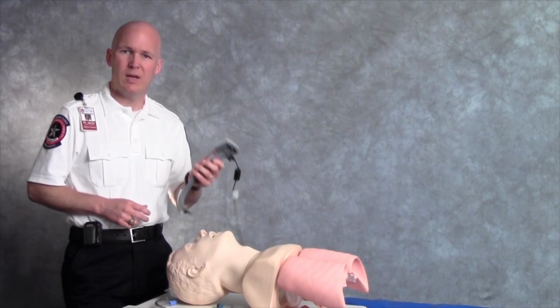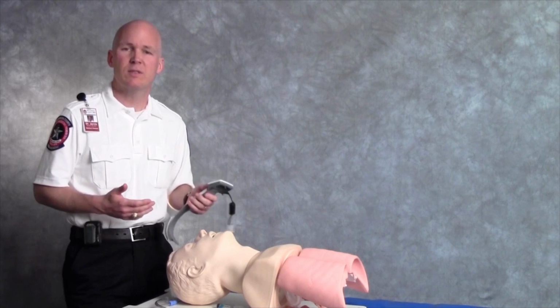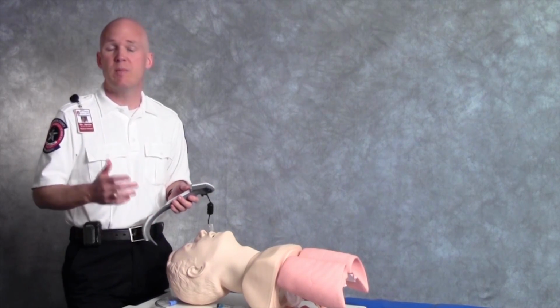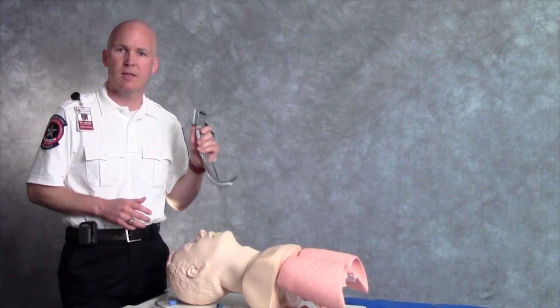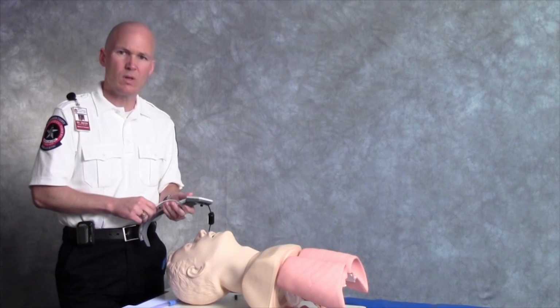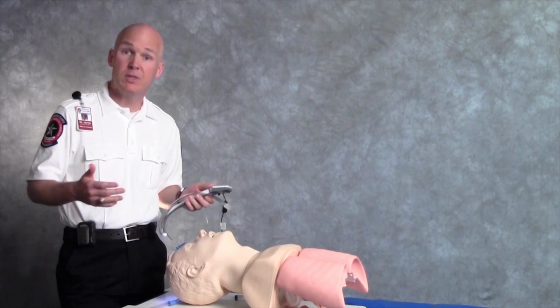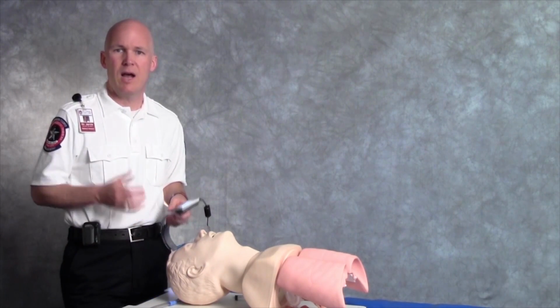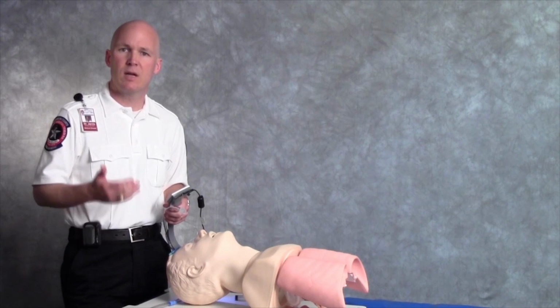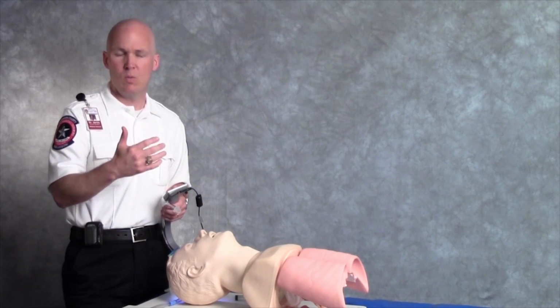It's very natural to hold the device high up on the blade. It feels right, feels comfortable, and probably most importantly, it feels like a traditional laryngoscope that we learned with. So when I hand a King Vision to anyone outside of our system, including my emergency physician colleagues, they pick it up exactly like this. Unfortunately, we found when holding the blade like this, it maximizes the risk of inserting the blade too deeply into the oropharynx. When this happens, the medic almost universally tells me the same thing: I had a great view of the cords, but I just couldn't get the tube to pass. So based on our experience, I know when I hear this that they went in too deeply, and they were almost certainly holding the blade way high up on the handle.